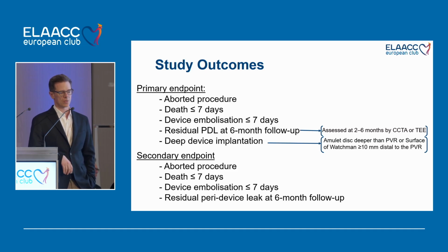And we also had a secondary endpoint that did not consider deep device implantation, so aborted procedure, death, device embolization, and residual peri-device leak at 6 months. So these were the two endpoints for which we tried to make a validation.